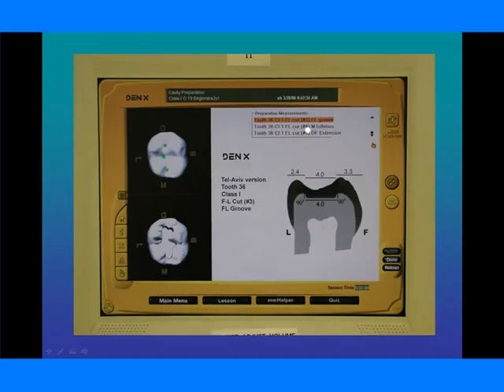Let's look at the next cut. Number 3 is our facial lingual cut or buccal lingual cut. This goes right through the center of the tooth here, buccal to lingual. You'll notice the width of that portion of our preparation is 4 millimeters wide. The walls are 90 degrees, basically parallel to one another. And I'm sorry about this slide, but the depth here too is about 2 millimeters.